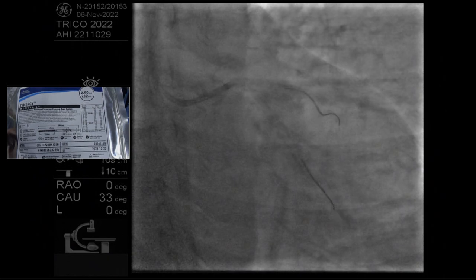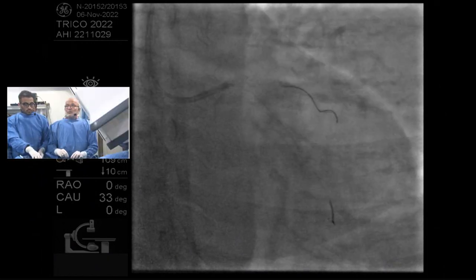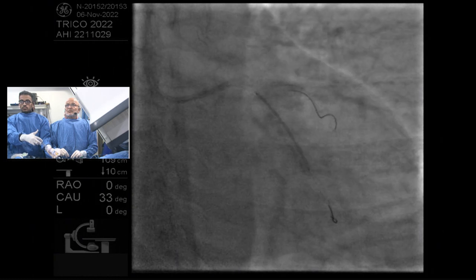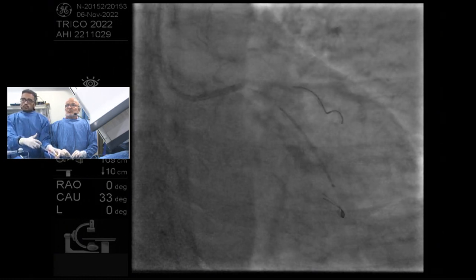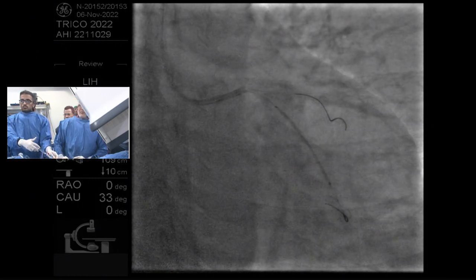So go ahead. I would bury your wire again because you're going to need the support. That's nice. And then we'll drop the... And what I would do is go past the lesion and pull the stent back because it's much easier to bring it backwards than forward. Right, your tension's out of the system then. So there we go. So pull back a little bit. Okay. And this looks so good. Stop there. Wait. Now, just one second. So now toggle back to your view.